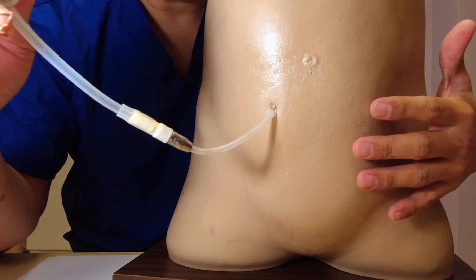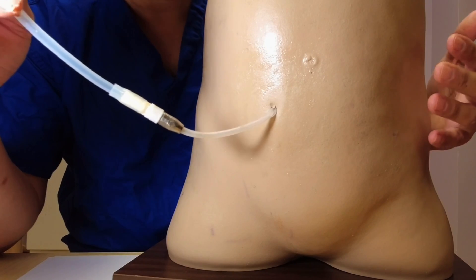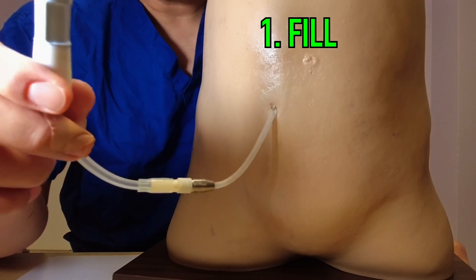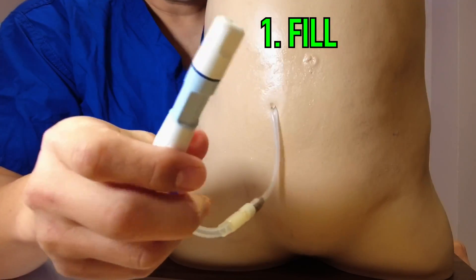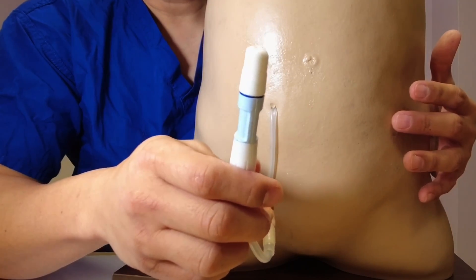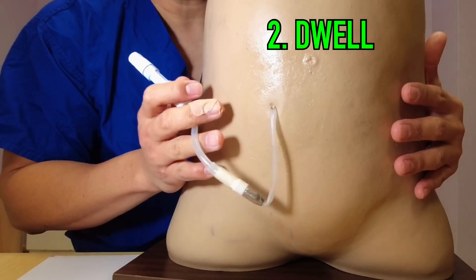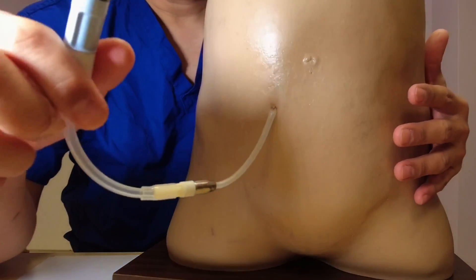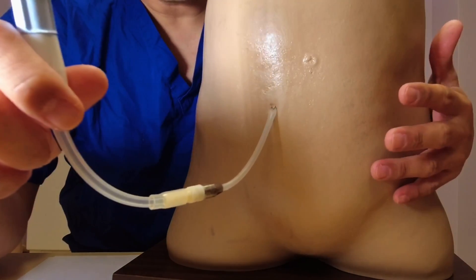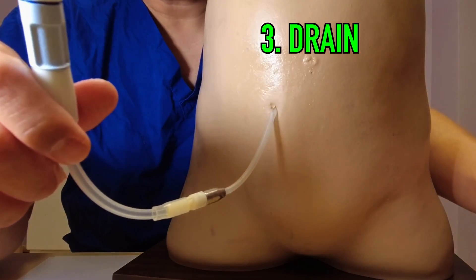What does the bag exchange consist of? There are three things in the bag exchange. Number one is the fill — we fill the peritoneal cavity with the solution. Number two is the dwell, where we keep the solution inside the peritoneum for a certain amount of time. And number three is the drain, where we take the solution out.